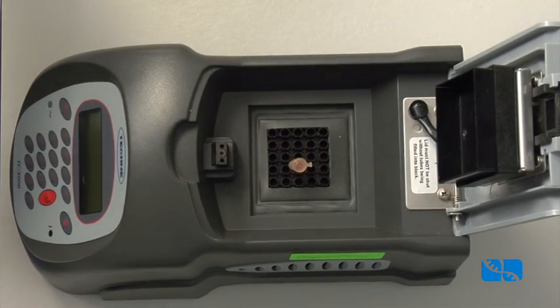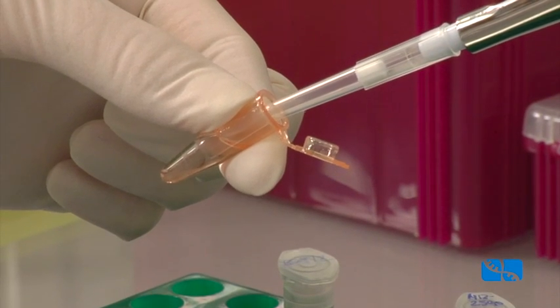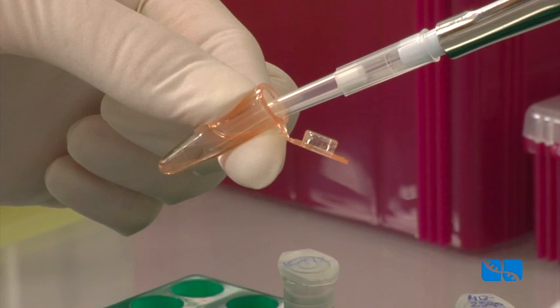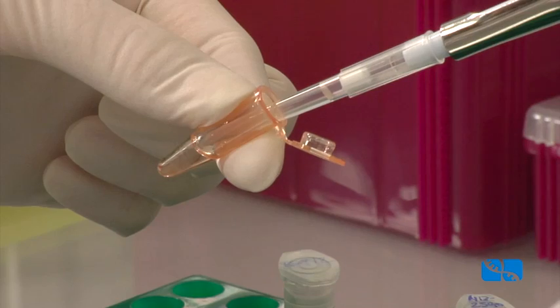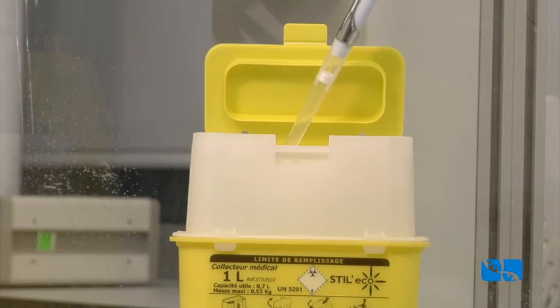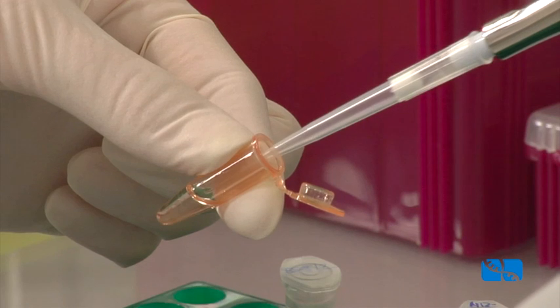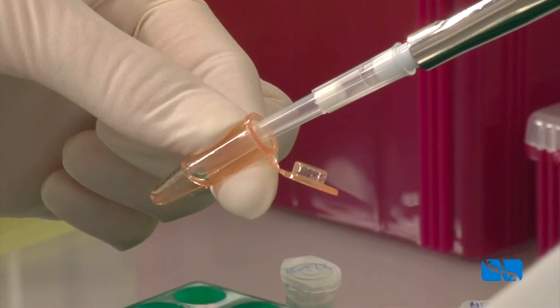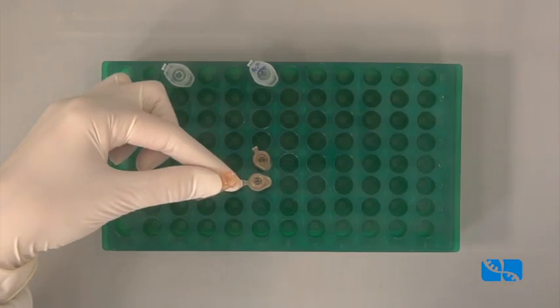Centrifuge samples at 2000 RPM for 1 to 2 minutes. Remove mineral oil very carefully. A certain amount of mineral oil can remain in the tubes to avoid removing part of the sample. In any case, the remaining mineral oil will not interfere in the following steps of the process. Repeat the former step as many times as samples must be processed.